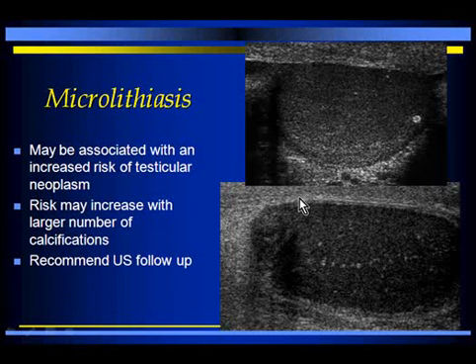Microlithiasis is a very interesting topic. It's something that's relatively common, and it's also relatively controversial. So here we see an ultrasound evaluation of a testis. This testicle has one little bright spot in it. But here's another testis, and this testis has multiple bright spots throughout.